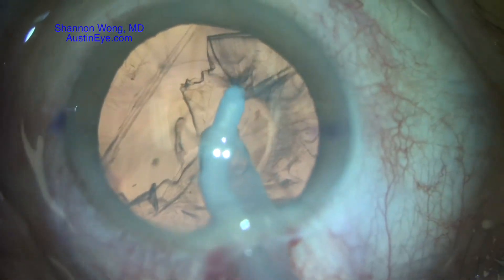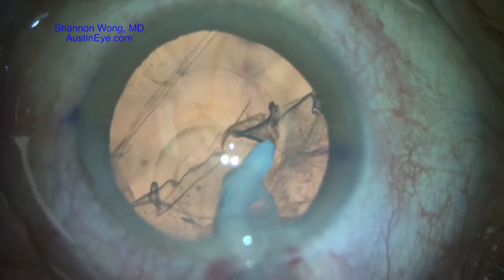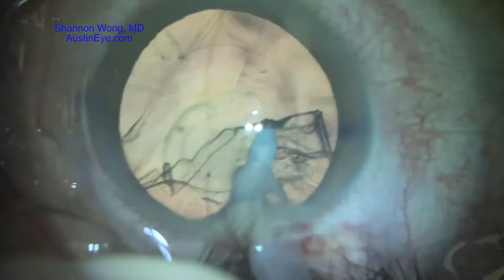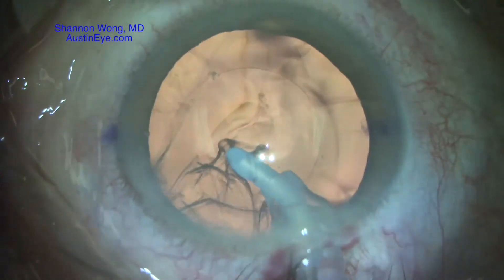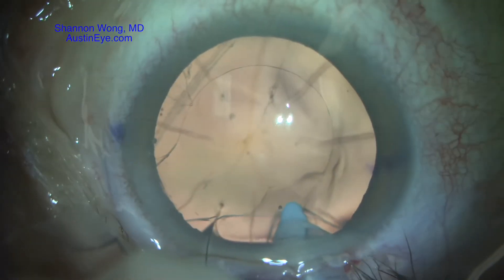Irrigation and aspiration is performed carefully. As we evacuate the residual cortical remains, we see the extent of the posterior capsule opening, which extends from approximately 12 o'clock to 7 o'clock.